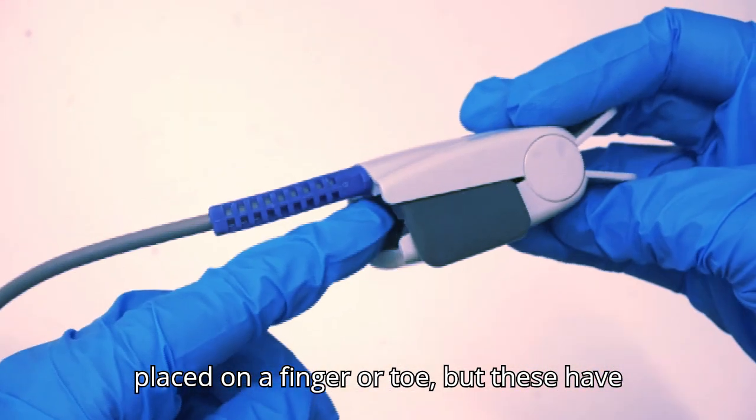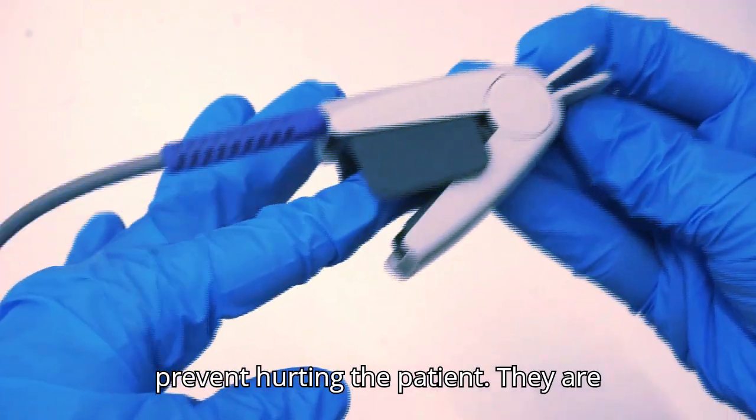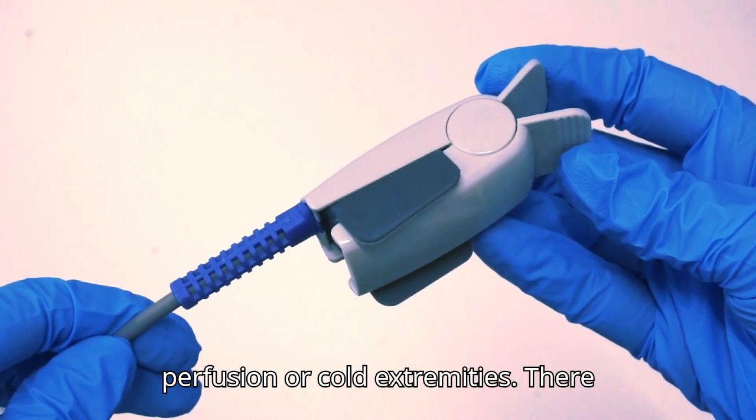These clips can be placed on a finger or toe, but these have to be moved every 4 to 8 hours to prevent hurting the patient. They are available in different sizes and work better than other types in case of poor perfusion or cold extremities.